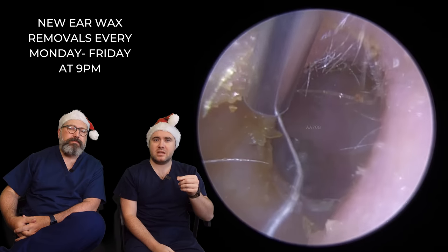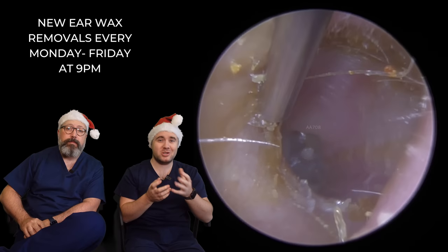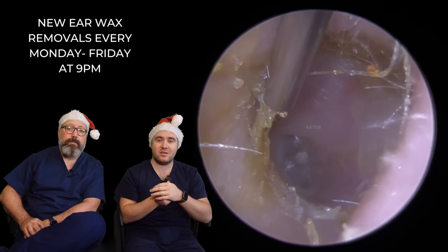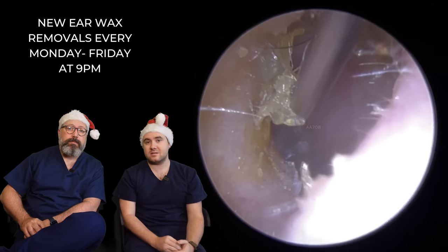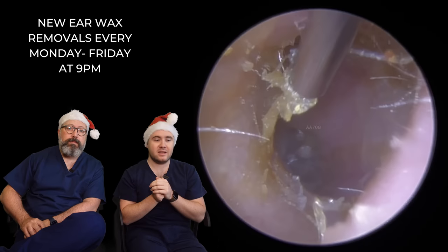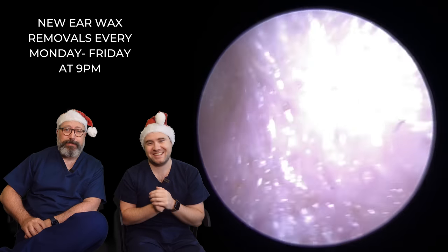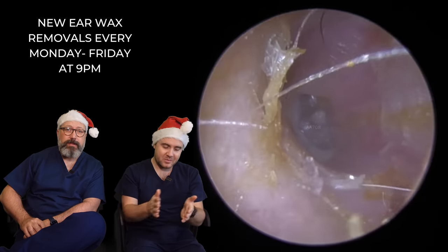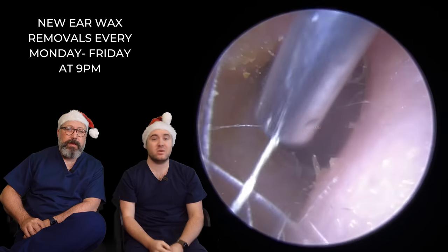This patient actually didn't realize the dome was in the ear - a similar story to your patient actually. The patient didn't realize this was actually in the ear. They thought the dome had fallen off onto the carpet. And like anything really small and tiny, as soon as it falls on the carpet, it's gone forever - you're never going to find it again. So he's obviously popped a new dome on and inserted the hearing aid again with this dome still in there, which has just kind of pushed it in a little bit further.